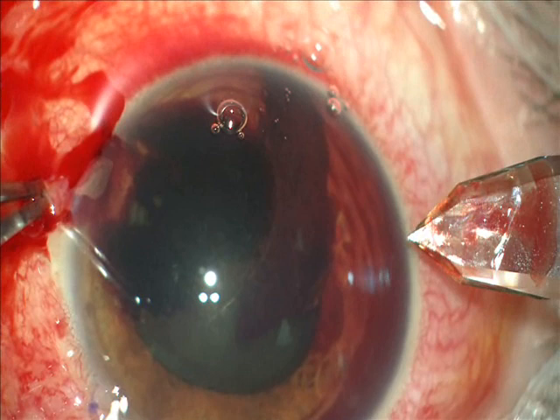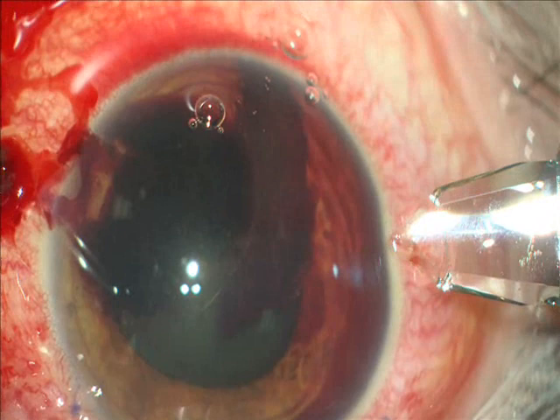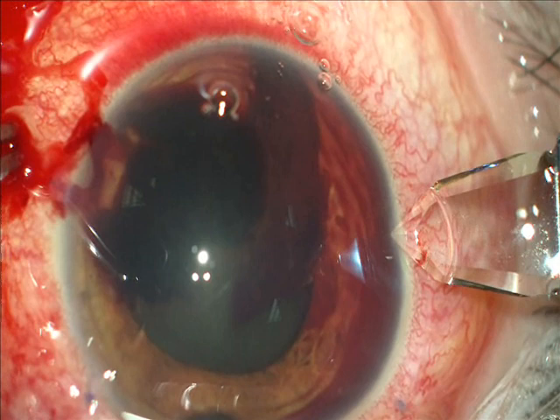I create with a diamond knife an entry to the Descemet's detachment and another one entering to the anterior chamber.